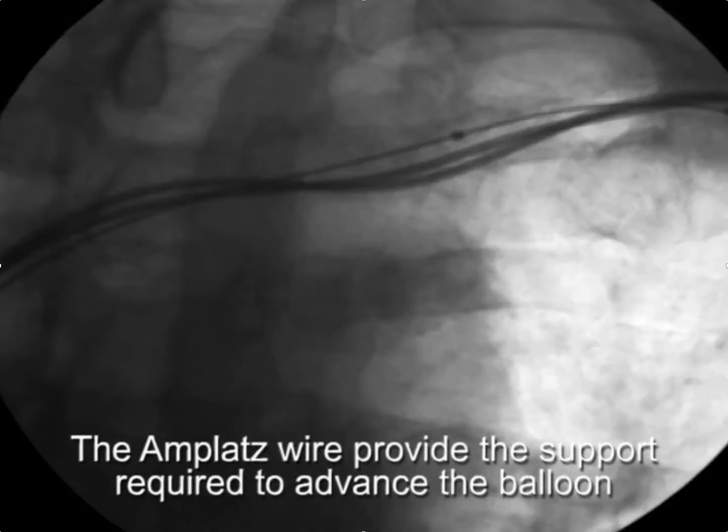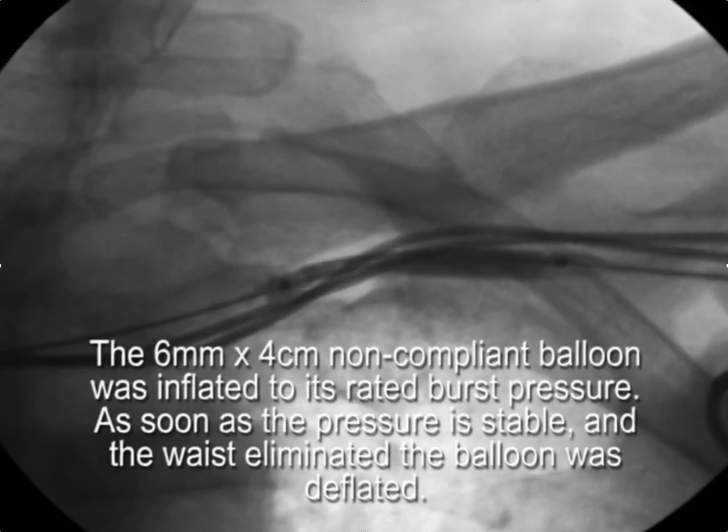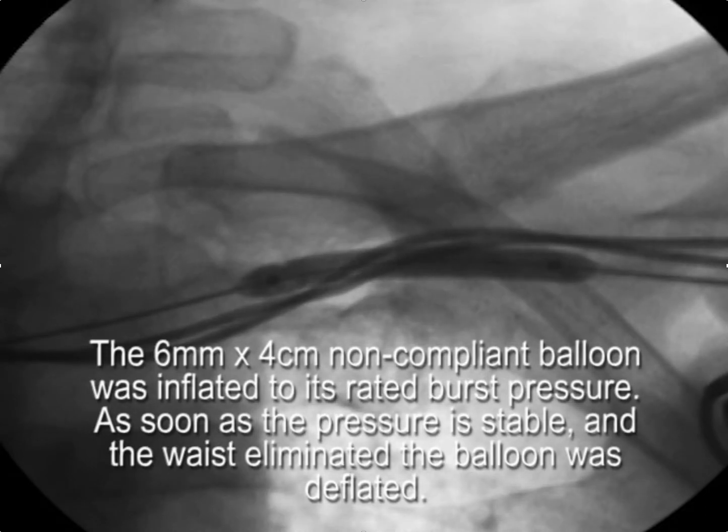In this case, we'll inflate the balloon to its rated burst pressure of 30 atmospheres — that's the balloon I use now. It's ultra non-compliant. You want to inflate the balloon until the waist is eliminated and the pressure is stable.